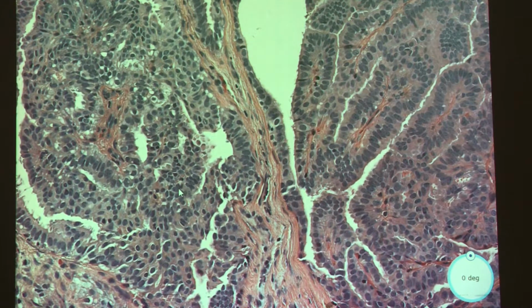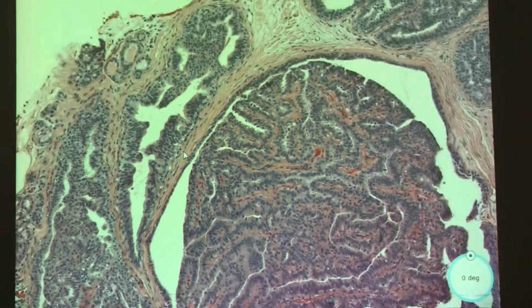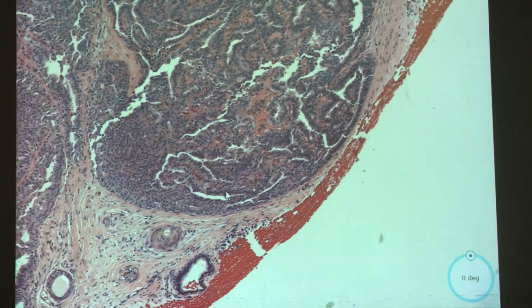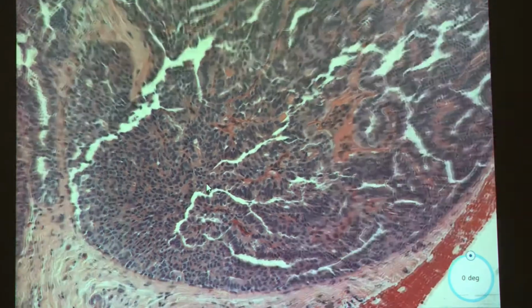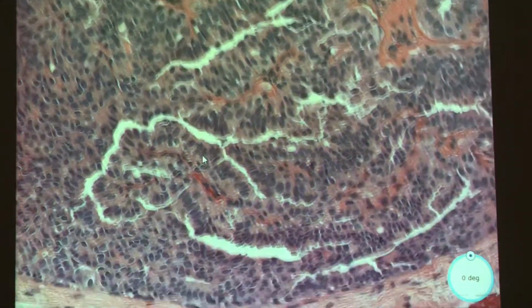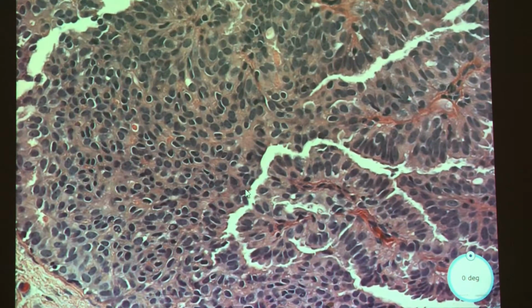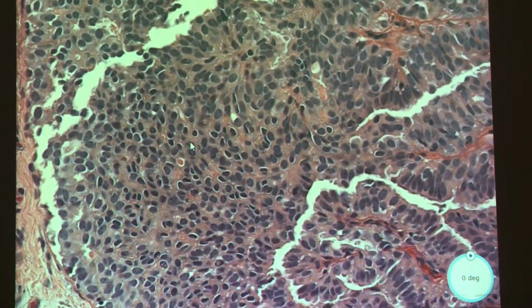Okay. But yeah, it does make it look a little funny. And you could argue whether there's some atypia or not. I let this one go in my 30-second perusal. But I think that's really nice where you see more pink, but they're still smushed, they're still crowded, so it's not ADH, right? Because with ADH, it's kind of like everyone wants their personal space. But it's hard because with apocrine metaplasia, they tend to get more cytoplasm.